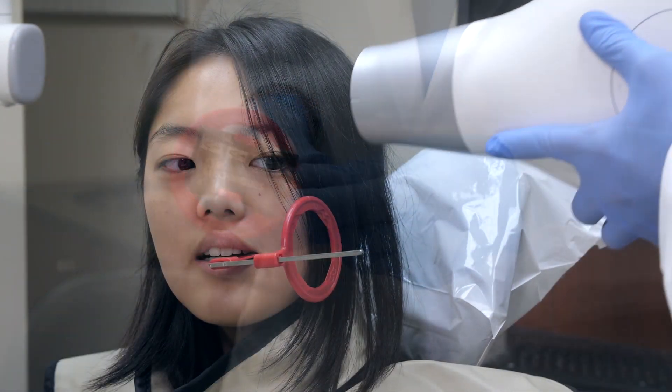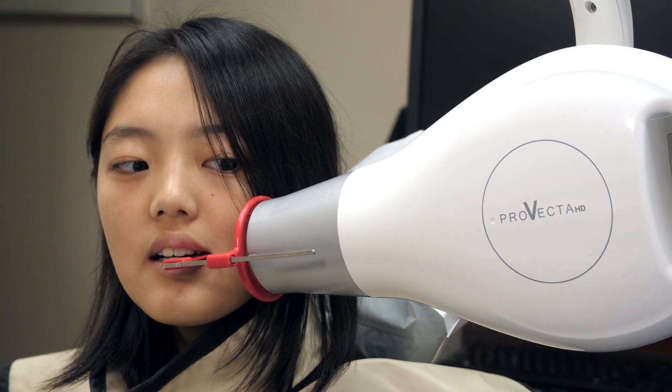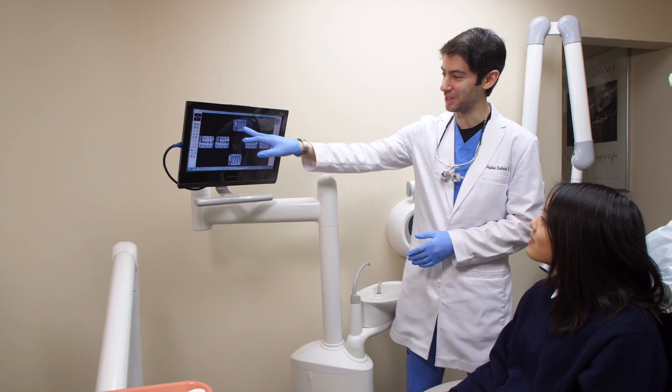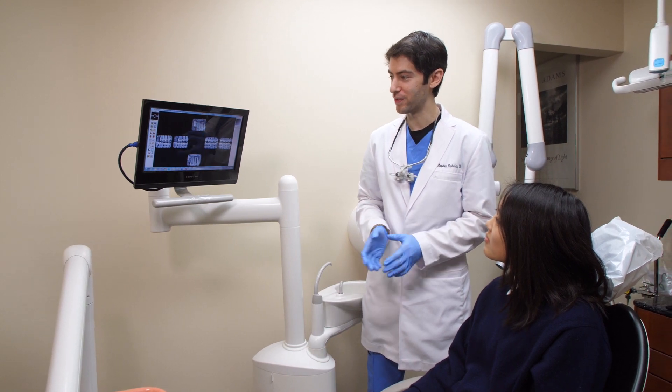The phosphor plates are offered in all intra-oral sizes 0 to 4, which is not the case with all imaging systems. The phosphor storage plates offer 100% coverage of the active area. This results in more diagnostic information per image, often requiring fewer x-rays, and my patients really appreciate the limited radiation exposure.